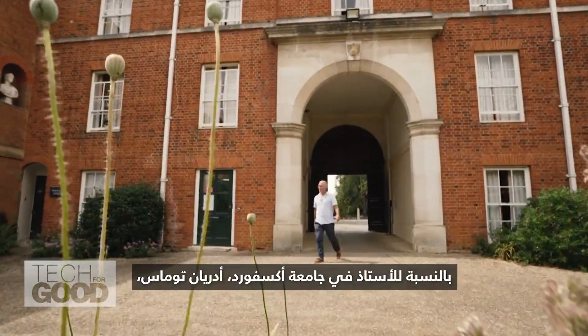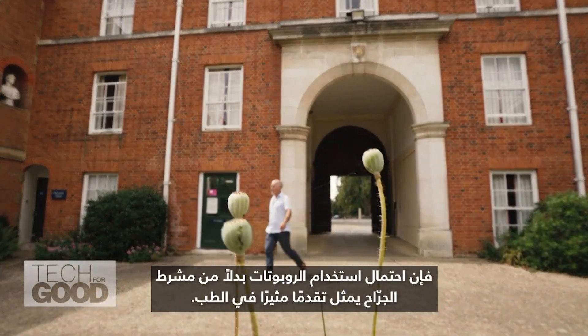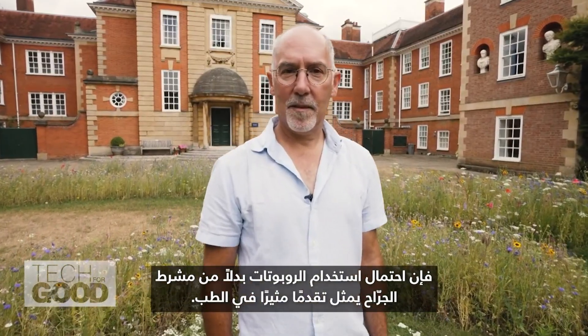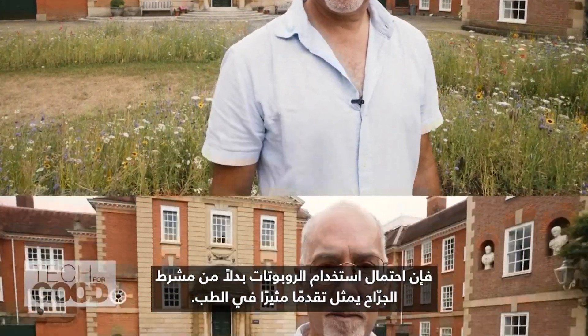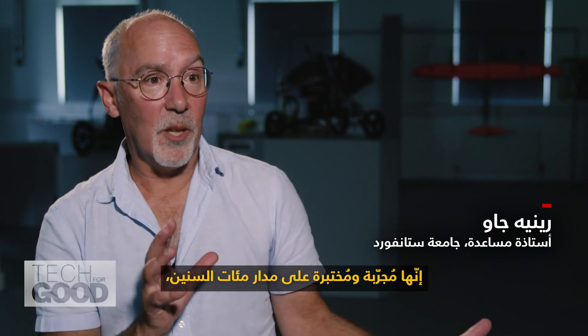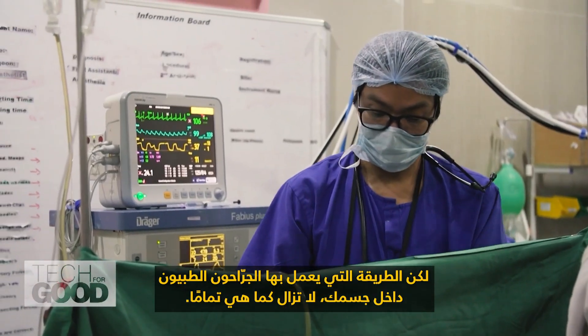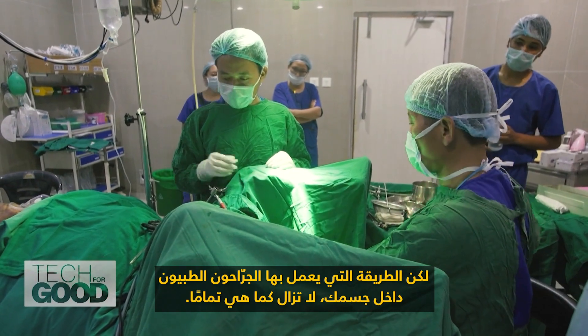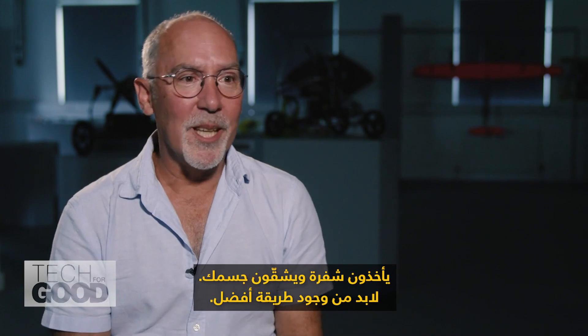For Oxford Professor Adrian Thomas, the prospect of using robots instead of a surgeon's scalpel is an exciting advancement in medicine. It's been tried and tested over hundreds of years, but the way that surgeons operate inside of your body is still exactly the same — they get a blade and they cut you open. There must be a better way.